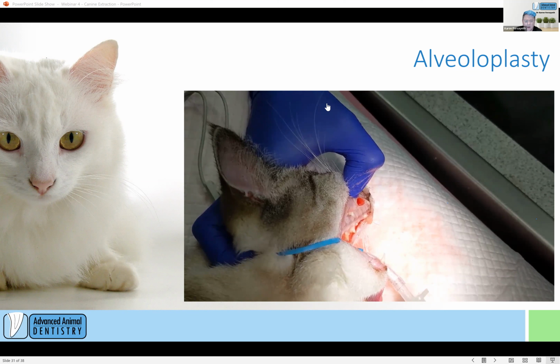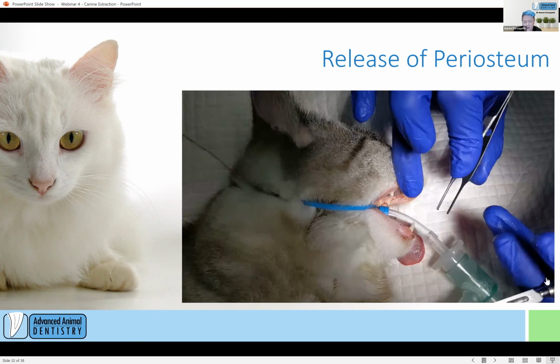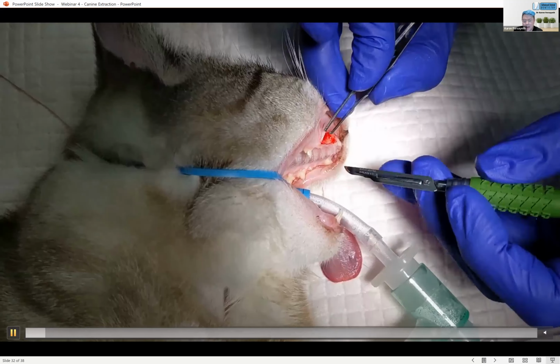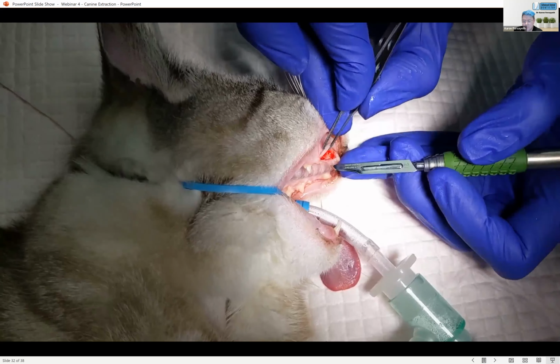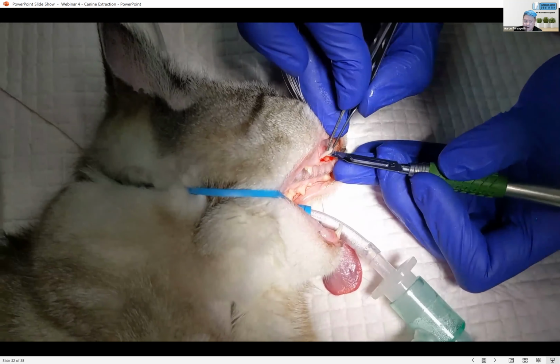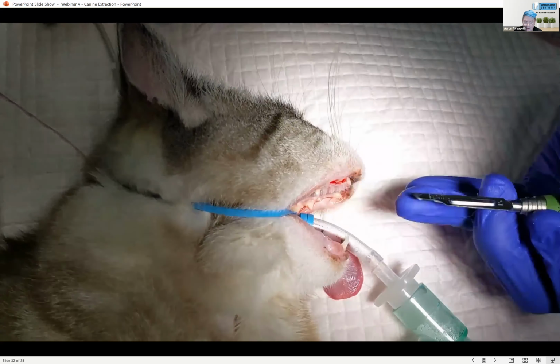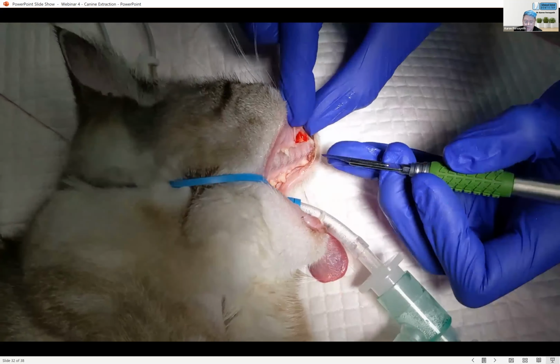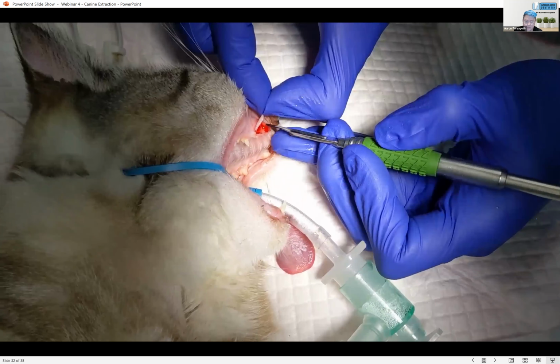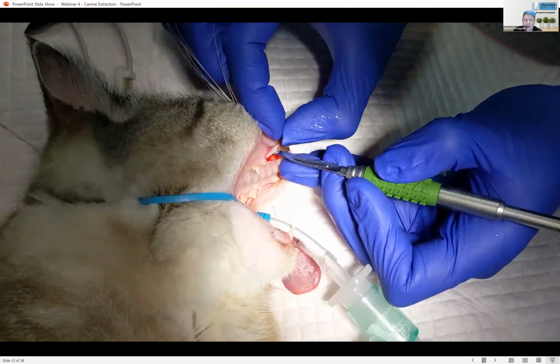So Jason's got a comment here really about use of the Vettome. The Vettome, if you've not come across it, is a mechanical periotome instrument that uses fine, sharp blades to incise the periodontal ligament. And Jason's used it previously to really get in that palatine aspect. And absolutely, a nice thin object like the blade of a periotome, or the Vettome specifically, will work down that area and break it down. And that's what we're aiming to do.